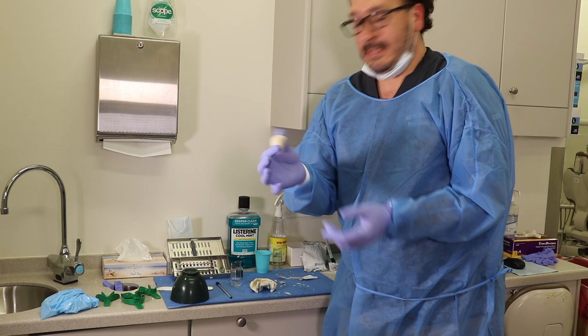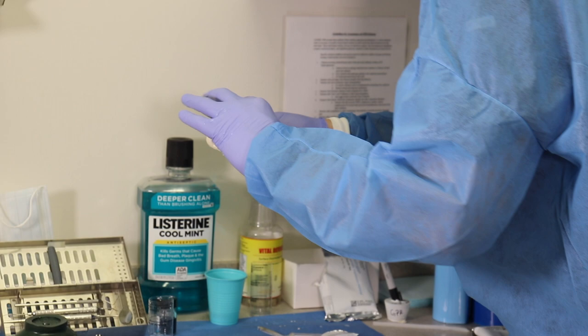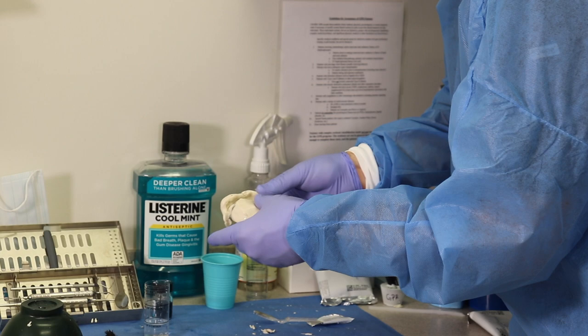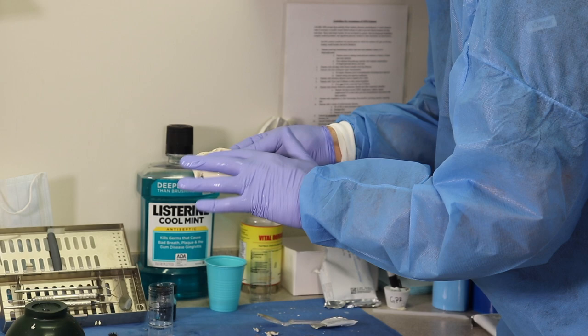And this, we'll just set it up here, and with some water, I'm just going to adapt this into the floor of the mouth, making the tongue space, filling up the tongue space with some alginate. That way, when I pour up the impressions, they will come out very, very smooth.